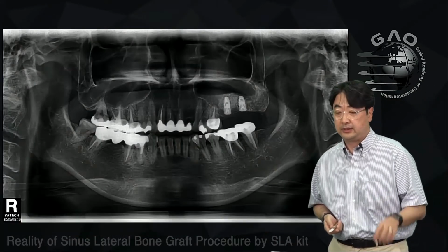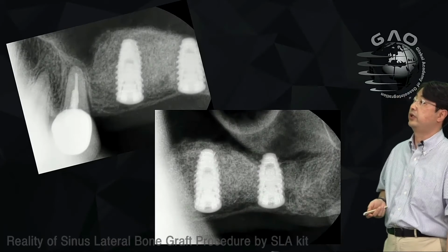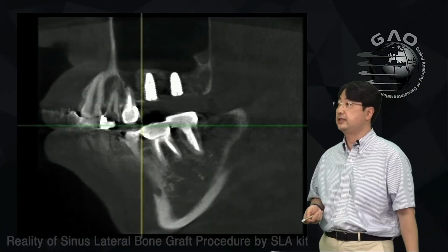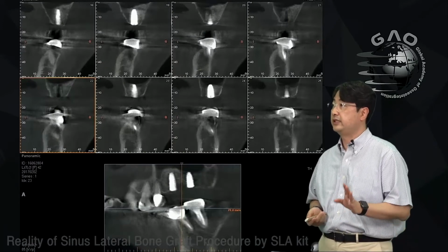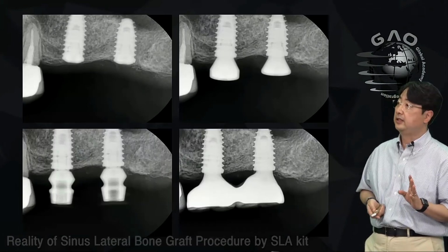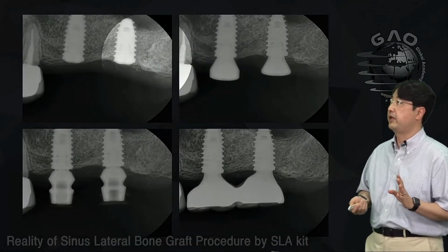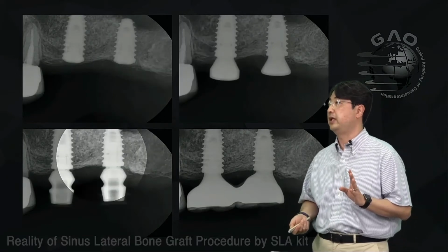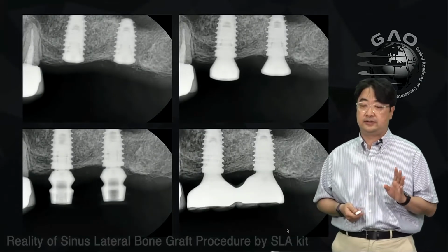Then I did the implant placement, and this is how it looked in the periapical radiograph. And this is a cut of the CT scan. Also, from the CT scan, you can see the bone graft around the implant, right? And again, these are the periapical pictures from implant placement, uncovery, impression making, and final restoration.